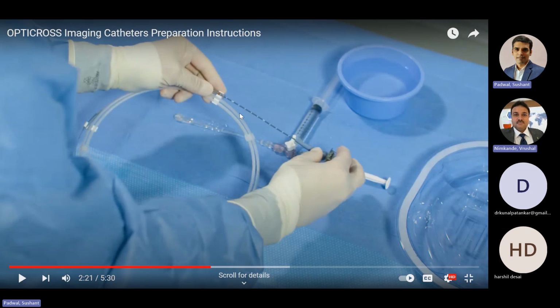So basically, this portion of the catheter with the dots is called the telescope. You must have seen those old era telescopes where from the binocular you pull the telescope out and then you focus better. This is just like that. This telescope has markings 1 centimeter apart, so each dot is 1 centimeter and a total of 15 dots will be there. So the total length is 150 mm.